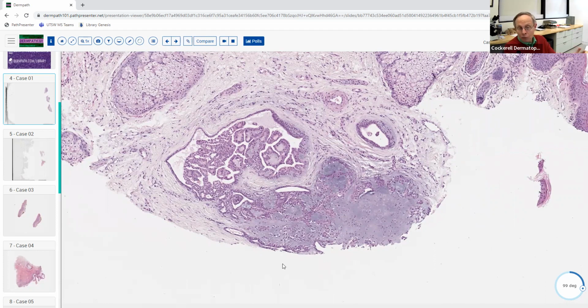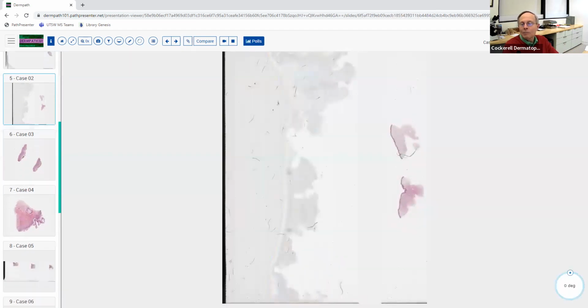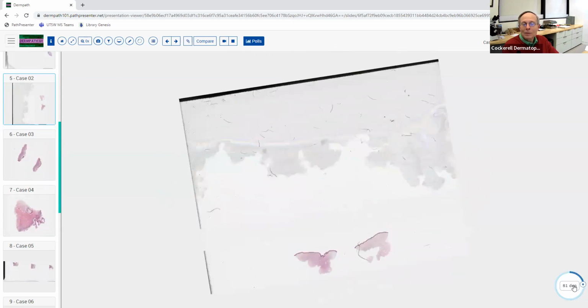It's basically analogous to a mixed tumor of the skin occurring in the salivary gland. They look pretty much the same. In those lesions, they actually have myoepithelial cells admixed with the salivary ducts and some of the glandular elements that are in there. But they can get chondroid differentiation also. And sometimes the cellular component can really predominate, and you just get very few little ductal structures and maybe very little of the chondroid material. So that's just something to remember. I don't think the board's going to ask you anything about that, but at least you can say you've heard about it. If you ever biopsy somebody's lip and it comes back as that, you'll kind of know what it means.